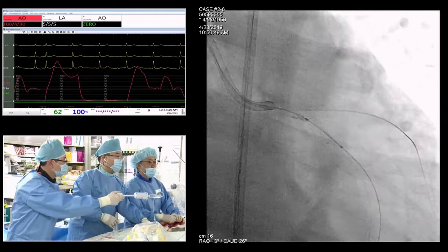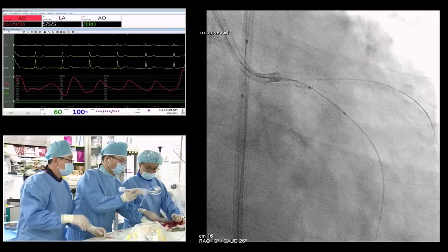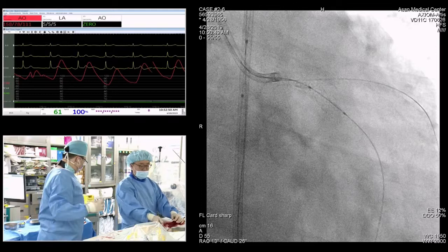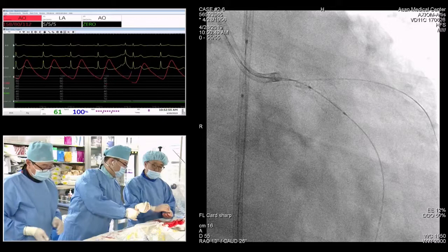Will you do a final POT with a 5.0 after the kiss? Usually, after the final kissing balloon dilation and after doing the IVUS, according to the position or some configuration that is too eccentric, I'm going to do a re-POT. Sometimes the morphology is okay, and I just finish after the kissing balloon dilation.